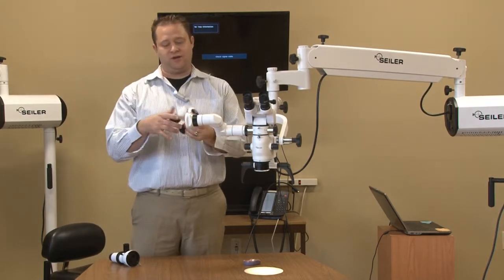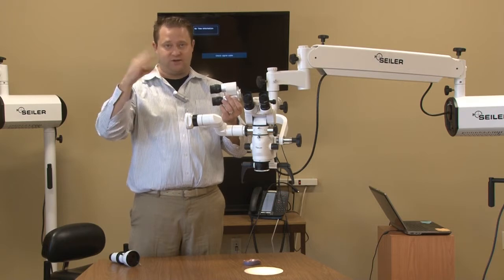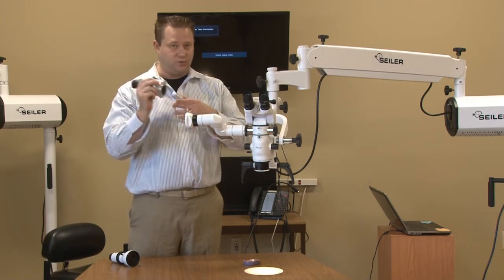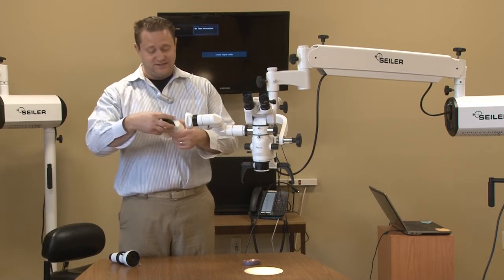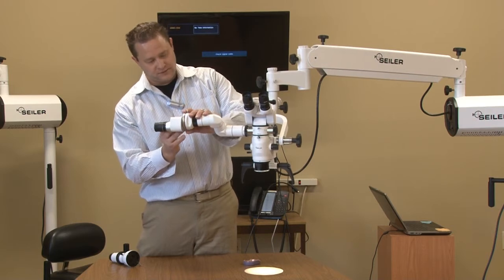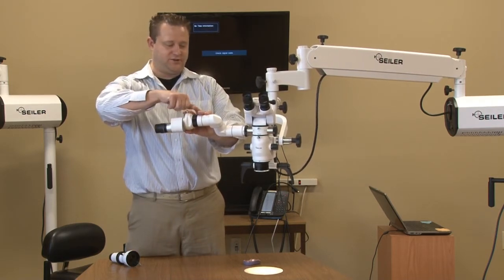Then we need to put on a straight head, a 0 to 220 inclinable head, or a fixed 45-degree head, depending on what the assistant needs. Right now we just have a straight head, so we're going to slide that right on and lock this into place.